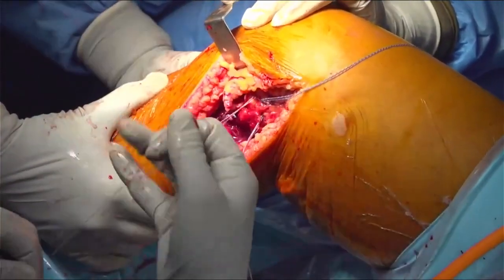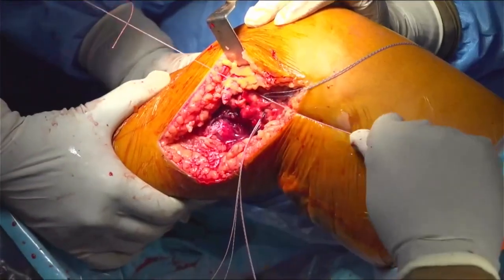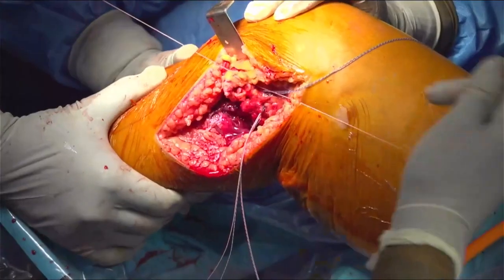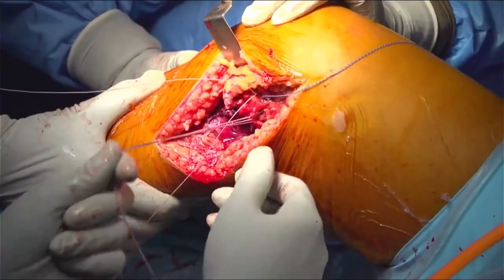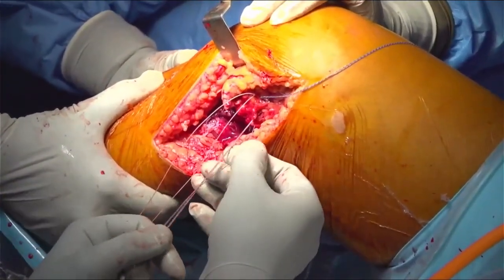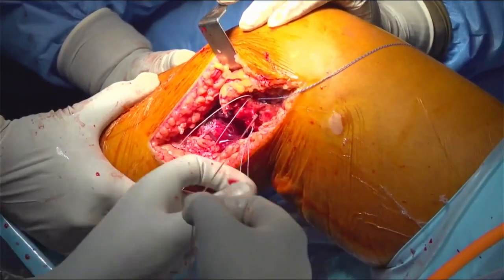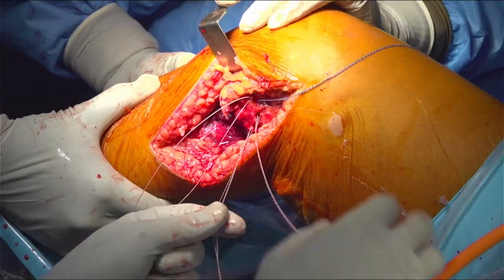LR anchor please. I have asked my assistant to pull an anterior drawer so that it is in a properly reduced anterior drawer configuration, because there is a posterior sag, and with these sutures we want to correct the posterior sag as well.